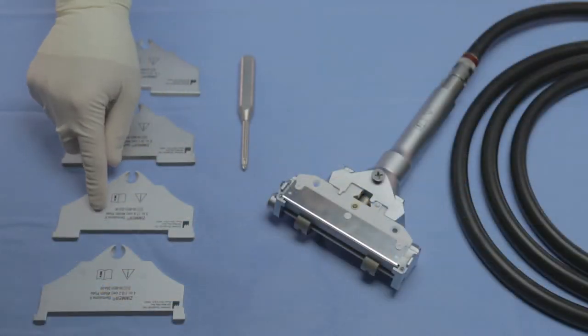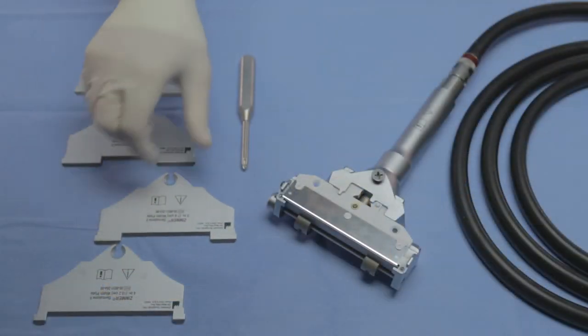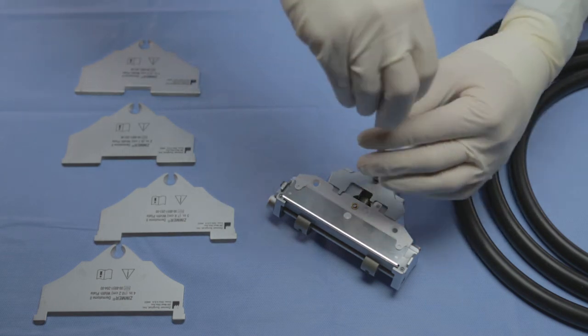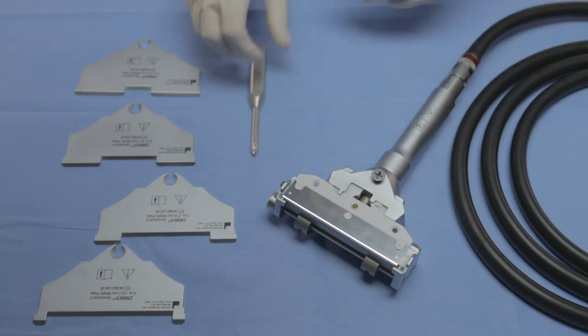Select the proper width plate as directed by the surgeon. Using the Zimmer screwdriver, loosen the width plate screw approximately two turns. Do not completely remove the screw from the handpiece.